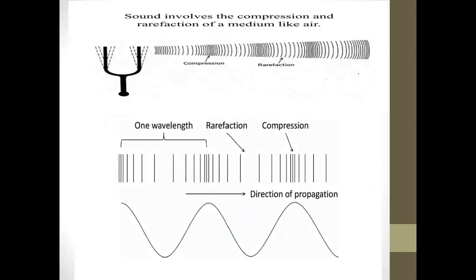But let's talk about the basic idea of how ultrasound production occurs. The whole idea is in an experiment called the tuning fork. If you remember, we use something called the tuning fork in the physics lab to create vibrations. When the tuning fork is struck, if we pay attention to ultrasound, I was talking about it being mechanical energy, right? So it is energy based on mechanics, dependent on movement.